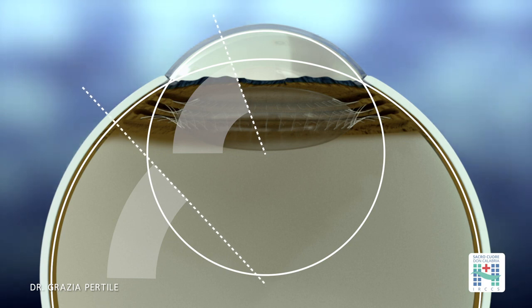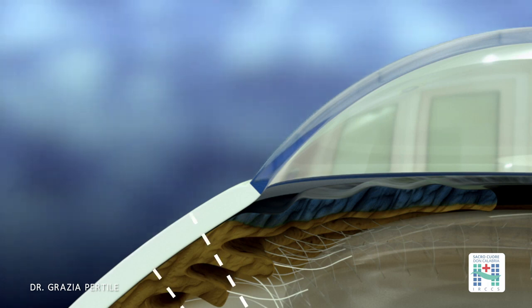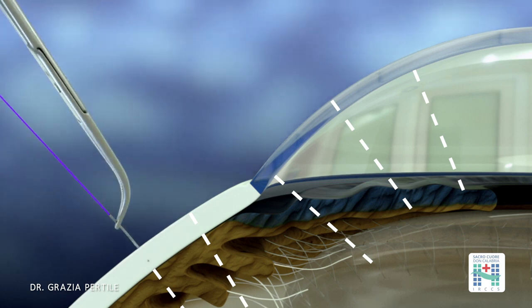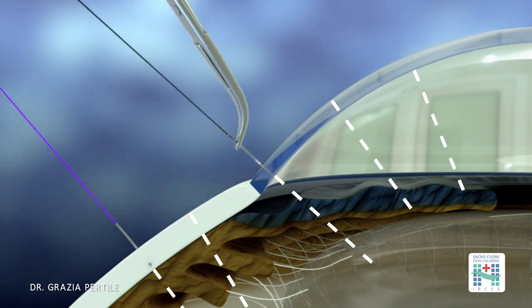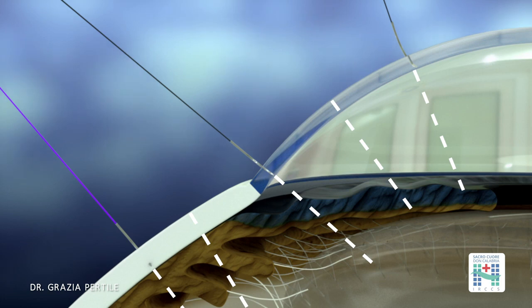Therefore, when preparing to suture a corneoscleral wound, one must think in 3 dimensions. The stitches should be placed while keeping the needle perpendicular to the tissue being sutured. In these images, we can observe how the needle's angle changes at different points on the sclera and the cornea. Care should be taken not to manage the eye as a flat surface.